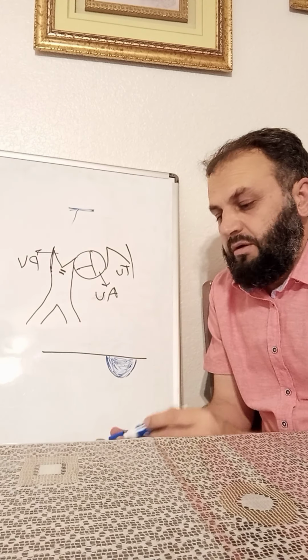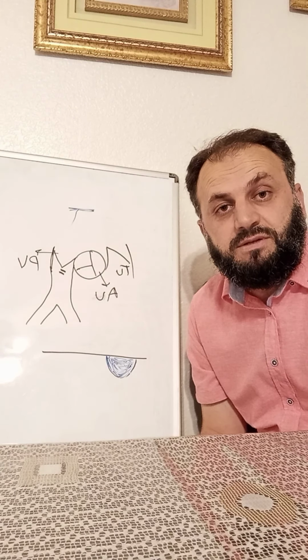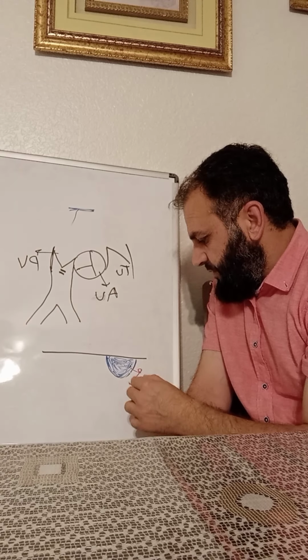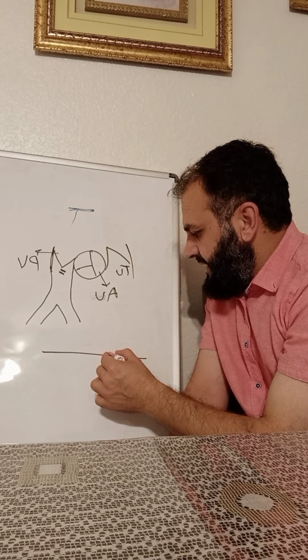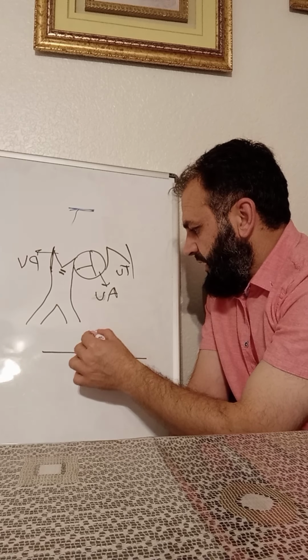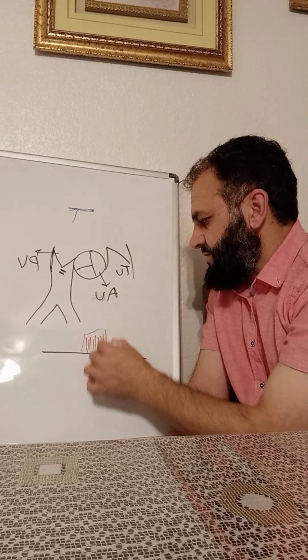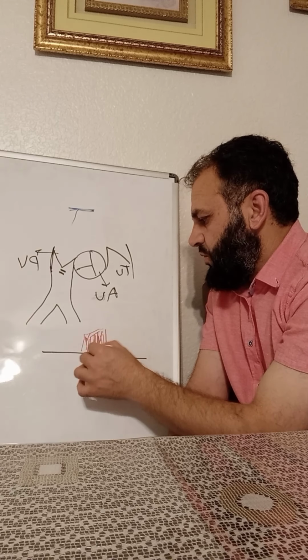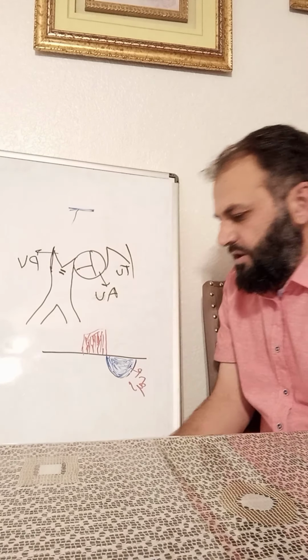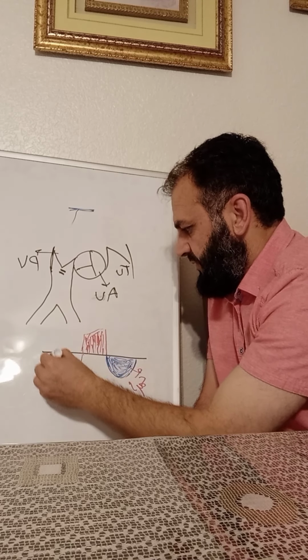But if there is any regurgitation or insufficiency on the pulmonary valve, this is our systole, and then in the diastole area we're going to see a regurg. It will be coming towards the transducer, towards where we are sending our sound. And again after that, we will see below the baseline, which is a normal flow.